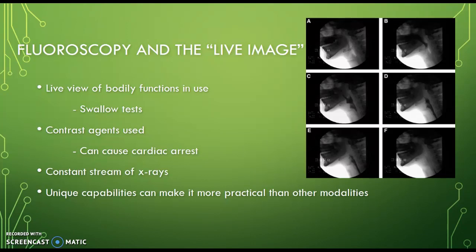You can see it moving down the person's mouth and throat, and then it kind of cuts off. But they use it to see how the person is able to swallow and how those parts of their body are functioning while they are being used. There's really nothing else like it that will show medical professionals how things move through the body in real time.